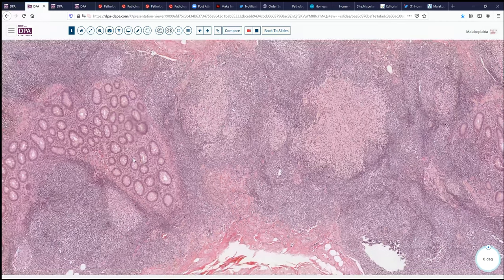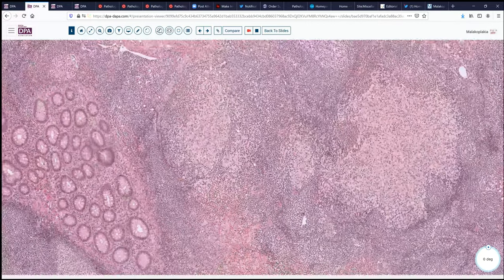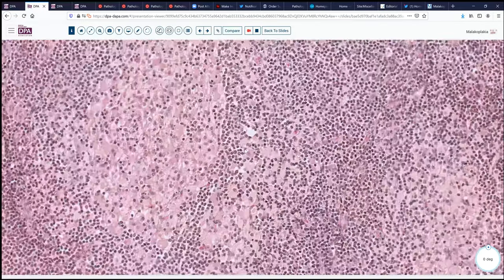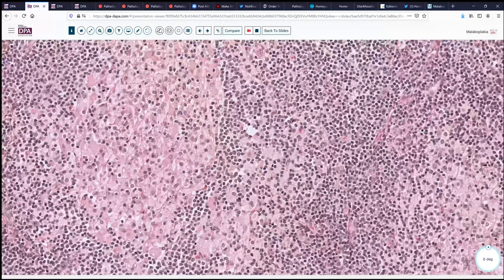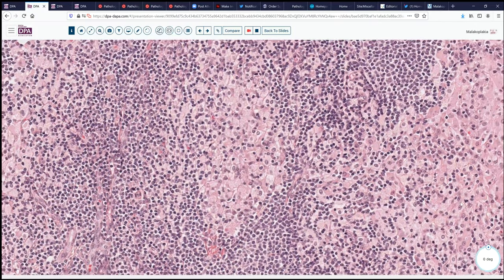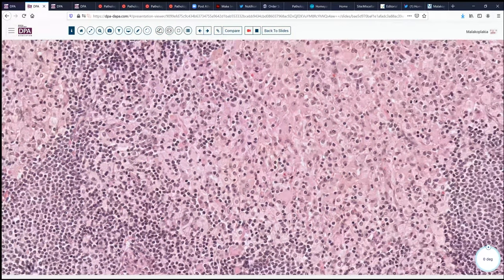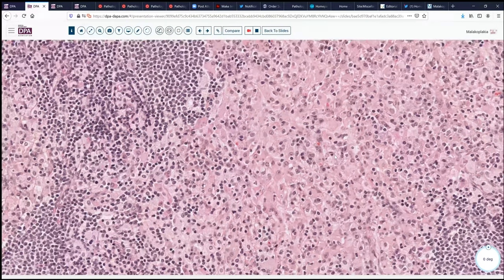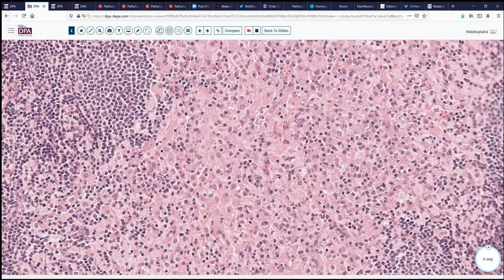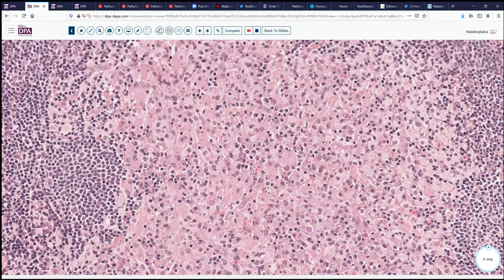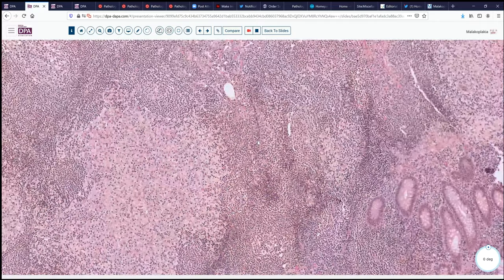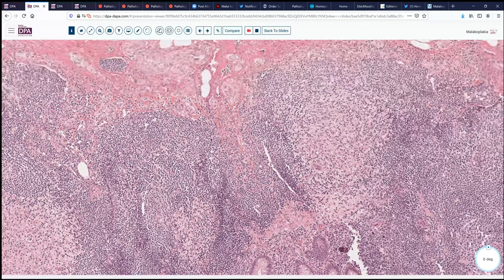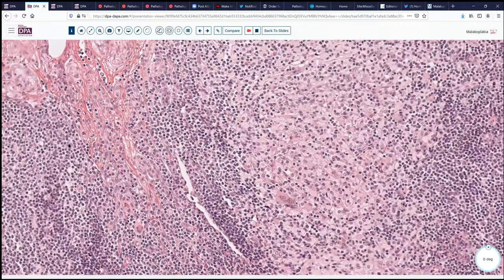We don't see in the mucosal areas any active inflammation, but we do see these clusters of pale cells. They have sort of a histiocytic type of appearance, a little bit of eosinophilic cytoplasm, some more pale cytoplasm here. There's really not too much distinguishing about them. There are some admixed lymphocytes, a few other sort of eosinophilic bodies. Here's another area over here with a few multinucleate cells. So these are not really forming tight granulomas.